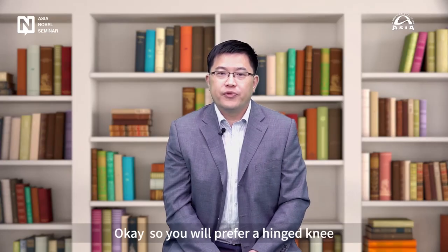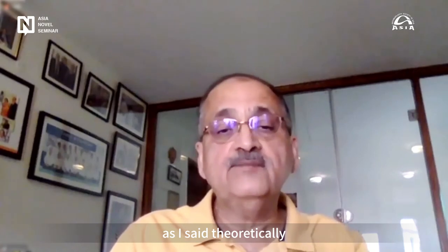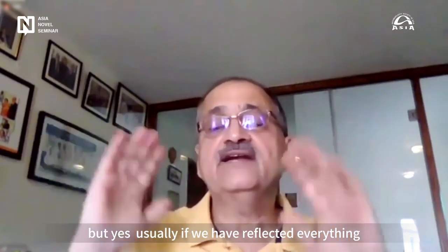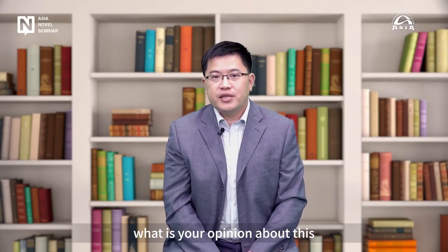Okay, so you will prefer a hinge knee after a skeletonization, right? Yes, if you're confident enough, as I said, theoretically. But usually, if we have reflected everything, then we would like to keep a hinged knee. Okay, and Dr. Parrott, what's your opinion about this?